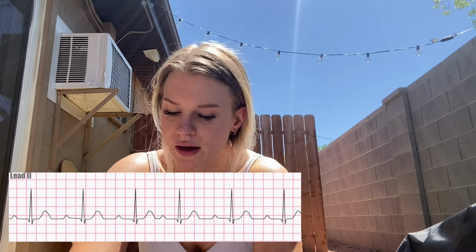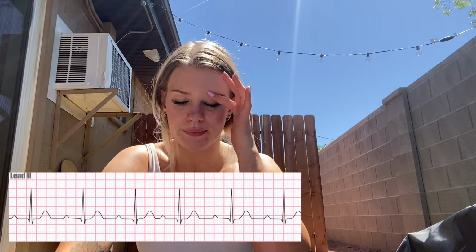Treatments for the first degree AV block are monitoring the patient, so get a 12 lead, get vital signs, and call the doctor if it's a new onset. And then external pacing initially, and then permanent pacing if the patient is symptomatic. Again, if they're not, then we're just probably going to ignore it. Not ignore it, but if it's not a new onset and it's chronic, then we probably won't do much.